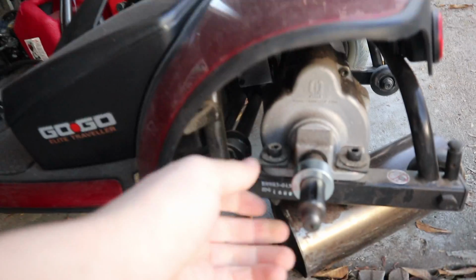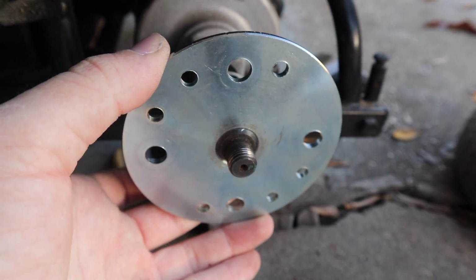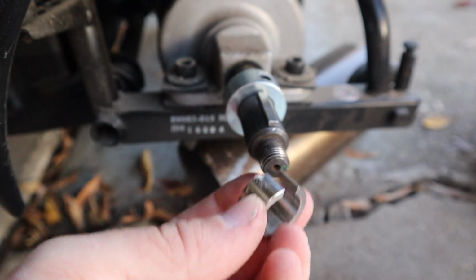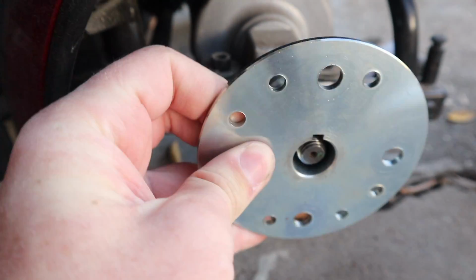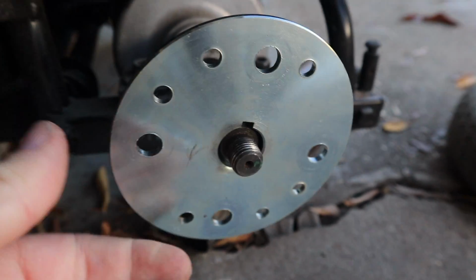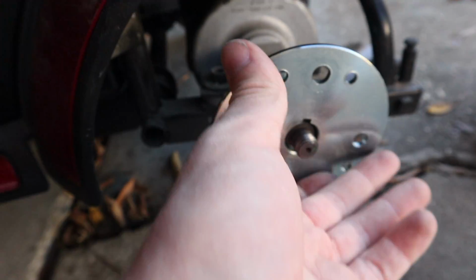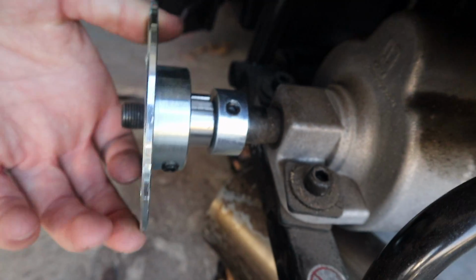slip that over the key, because when I have the lock collar on, this is going to be not long enough for the bolt to put pressure on it. So when the key's in, and then I slip the piece that I cut on, and then this after, I have enough for the bolt to put pressure on the entire shaft with all the attachments on there.